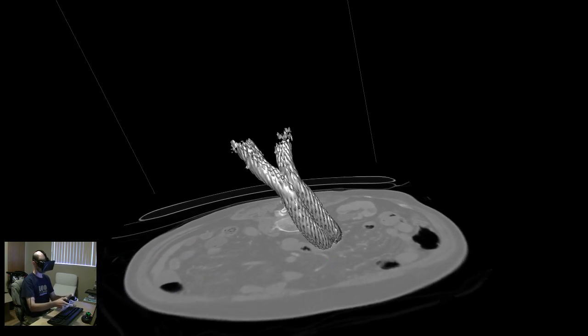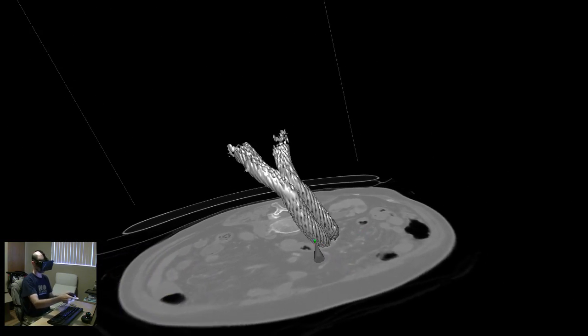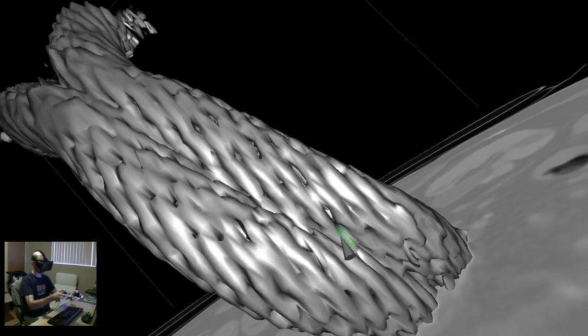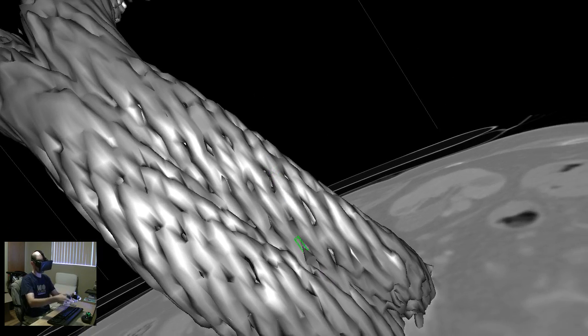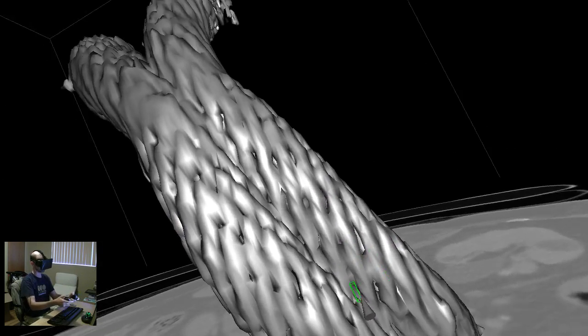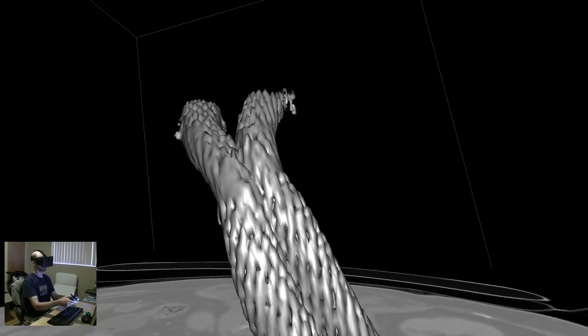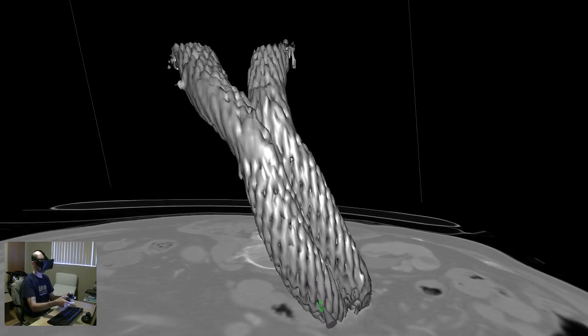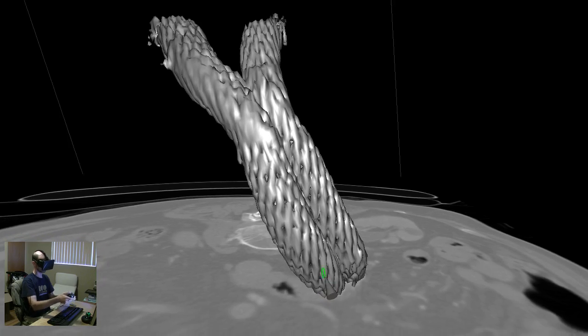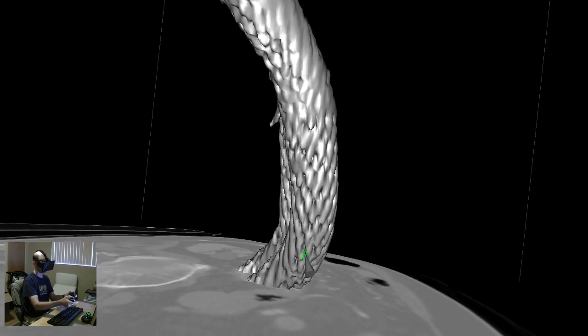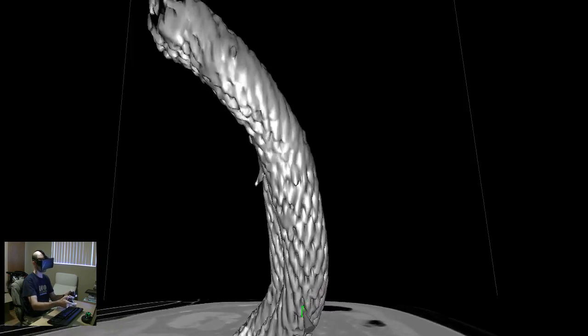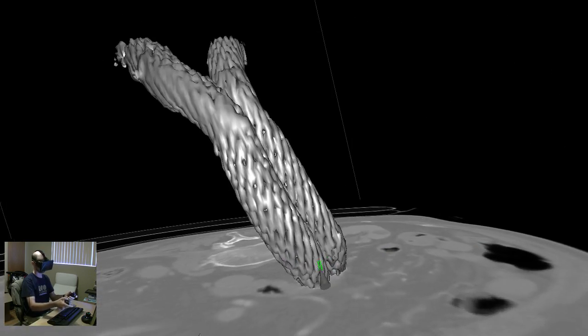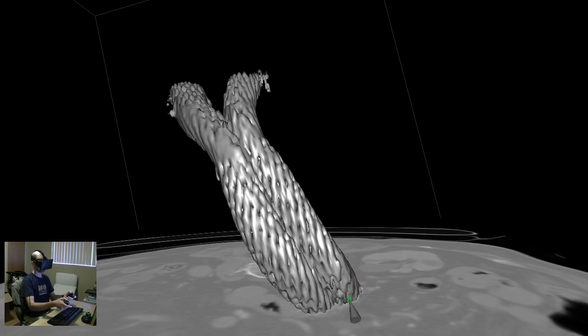This is an abdominal aortal stent, which is a metal mesh. You can see here the individual metal wires. It's like a chicken wire mesh, only really tiny. That was inserted into this patient's abdominal aorta to prevent the blood from forming an aneurysm, a balloon, that can potentially pop, and it will probably kill the patient at that point. So this mesh is supposed to prevent that.